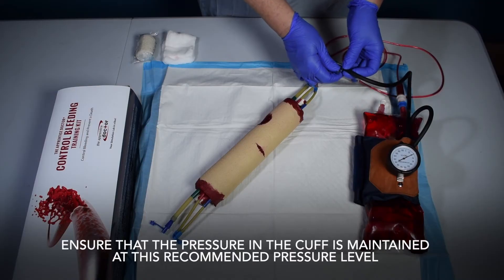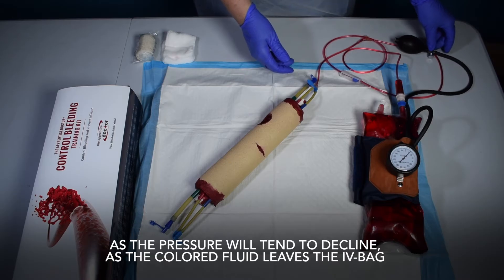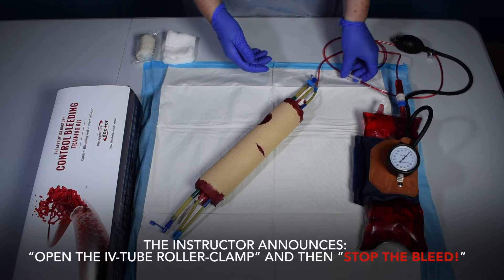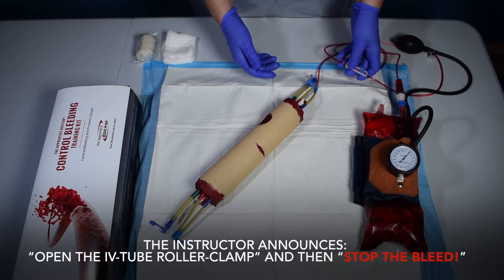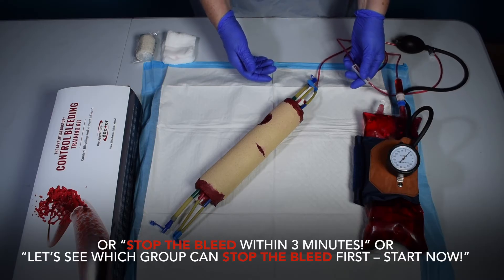Ensure that the pressure in the cuff is maintained at this recommended pressure level, as the pressure will tend to decline as the colored fluid leaves the IV bag. The instructor opens the roller clamp valve on the IV tube and instructs: "Stop the bleed" or "Stop the bleed within 3 minutes."